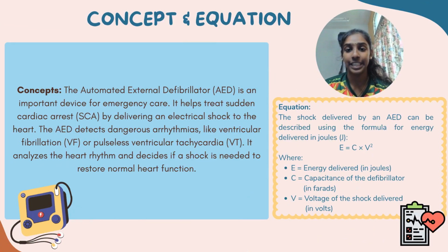Now moving on to the EMT concepts. The automated external defibrillator, AED, is an important device for emergency care. It helps treat sudden cardiac arrest by delivering an electrical shock to the heart. The AED detects dangerous arrhythmias like ventricular fibrillation or pulseless ventricular tachycardia. It analyzes the heart rhythm and decides if a shock is needed to restore normal heart function.